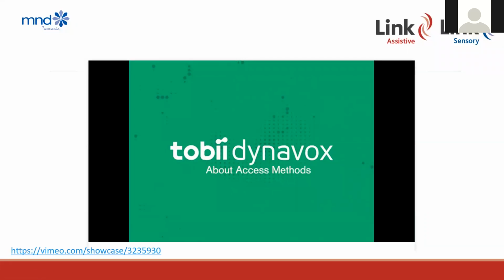The technology in that particular clip is a little outdated, so the software and everything isn't current, but it gives you a visual overview of what those different access method options are. This is one of your biggest points of decision when choosing an assistive technology solution: thinking about how the person is going to access it.